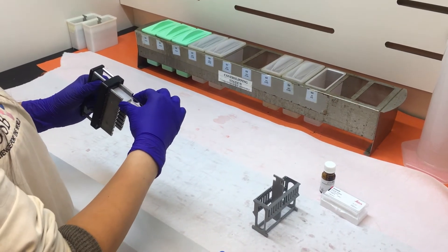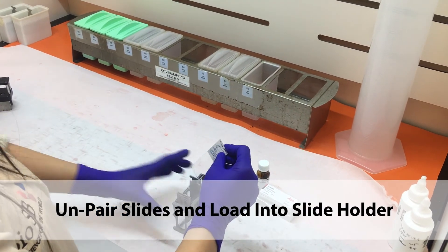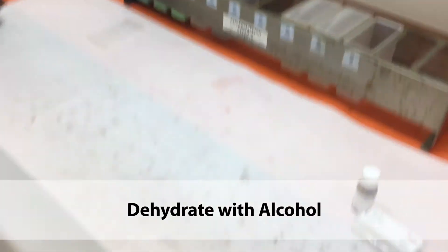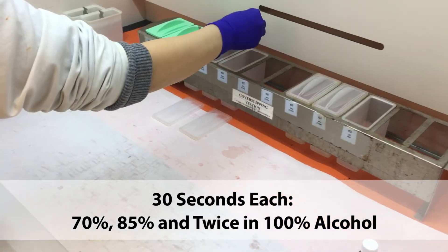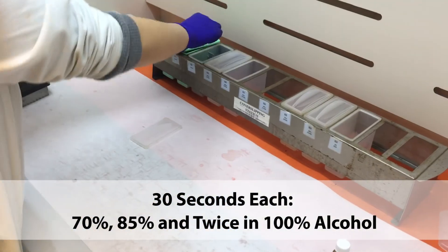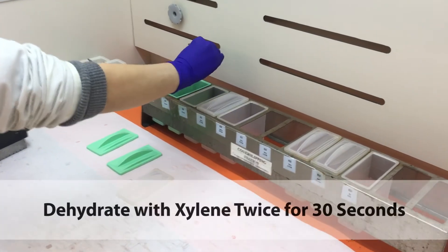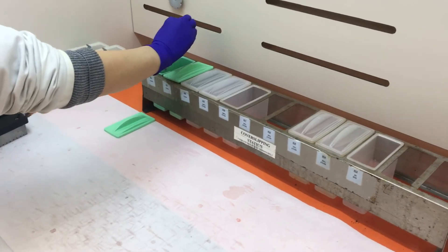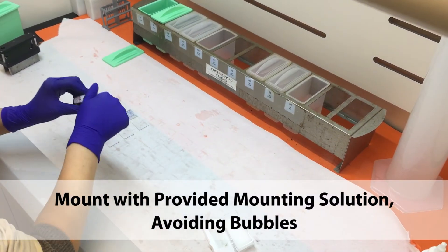Moving on to the mounting station, unpair the slides from the slide handle and load into the slide holder. Dehydrate with alcohol for 30 seconds each at 70%, 85%, and twice at 100%. Dehydrate with xylene twice for 30 seconds. Mount with the provided mounting solution, making sure to avoid bubbles.